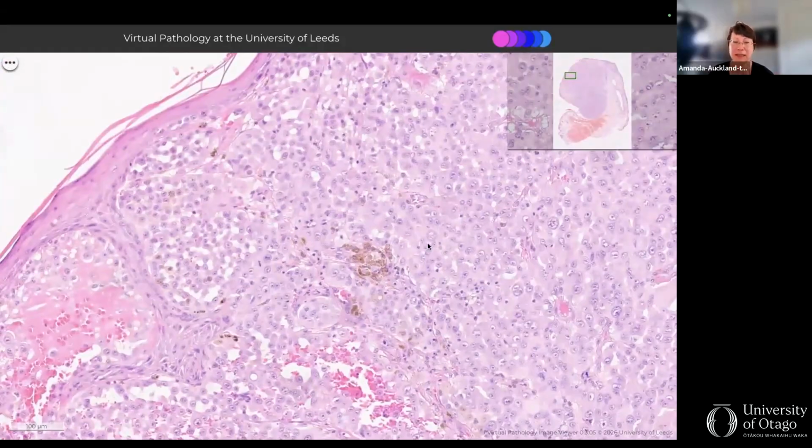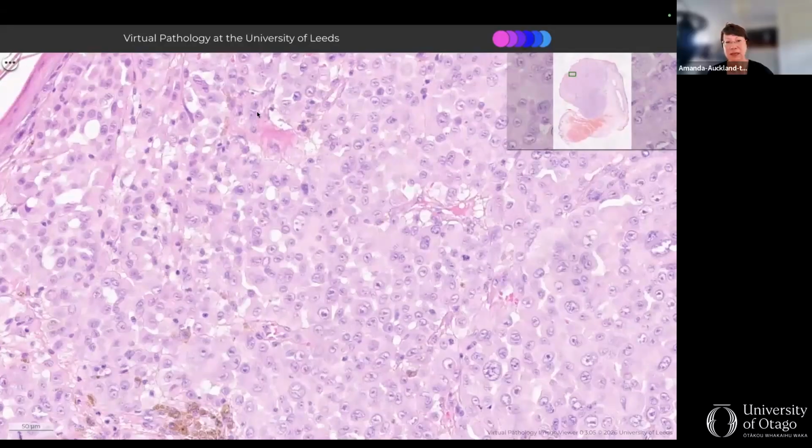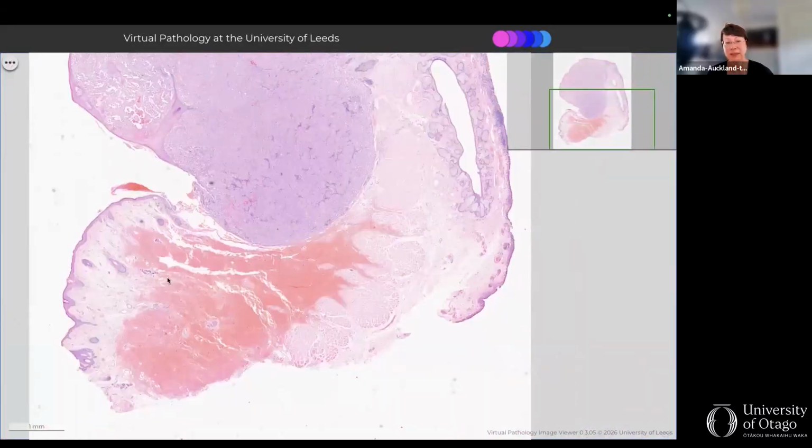But look at this. I can see that these are very big round epithelioid cells. They look like fried eggs with big nuclei. There's a lot of brown stuff, most likely melanin, here, probably in macrophages. They don't look like basal epithelial cells to me, and it's not making squamous, it's not doing peripheral palisade, it's making brown stuff. I think this is a melanoma. It's not a nevus, it's too big, it's destructive, and it's at the margin. So features of malignancy: nuclear size, pleomorphism, there were mitotic figures.